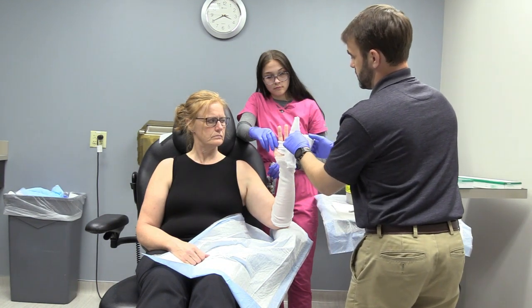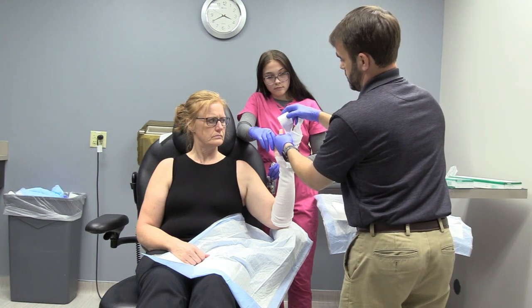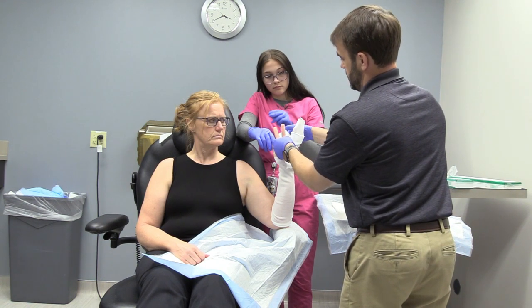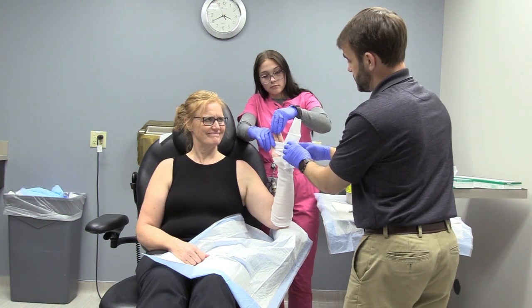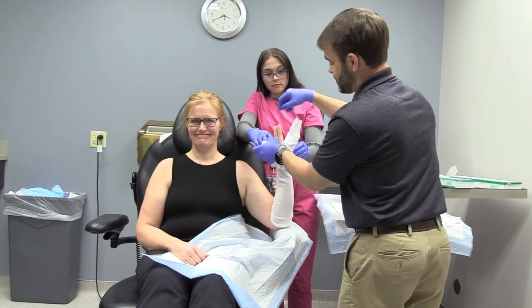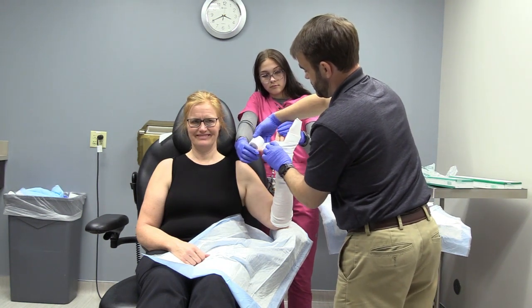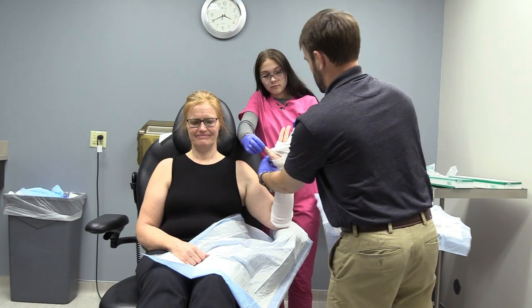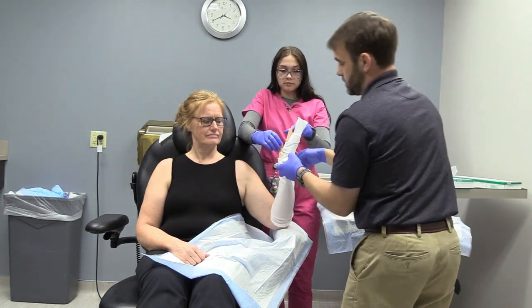So I usually wrap the fingers first, just because they're right there. Why not? And then have the patient do that. You can hold their hand. Almost everybody tries to help you when you're splinting them, and none of them should, but you'll have to coach them through it. Thumb out, there we go. And we'll just kind of show you the side view later too.